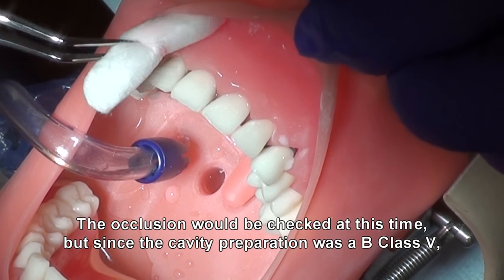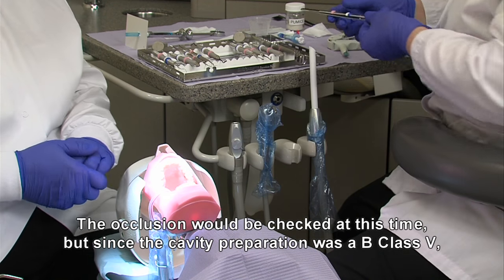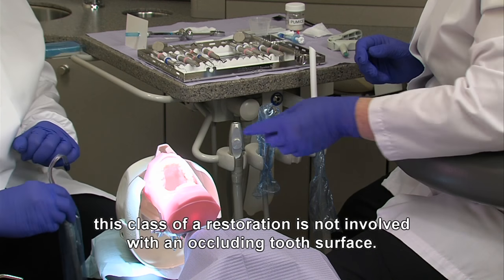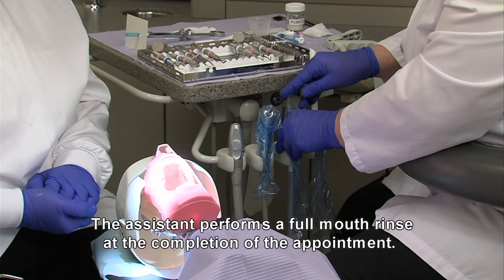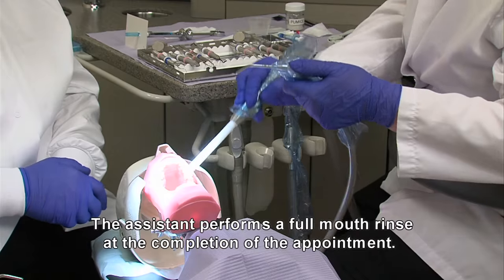The occlusion would be checked at this time, but since the cavity preparation was a buccal class 5, this class of restoration is not involved with an occluding tooth surface. The assistant performs a full mouth rinse at the completion of the appointment.